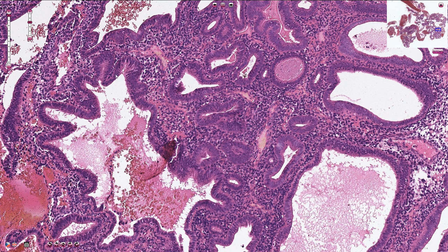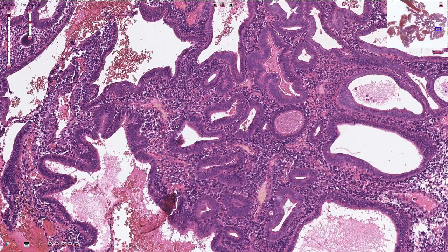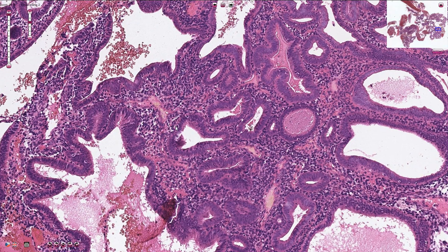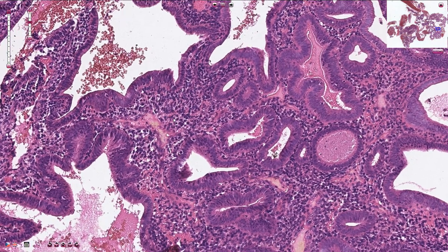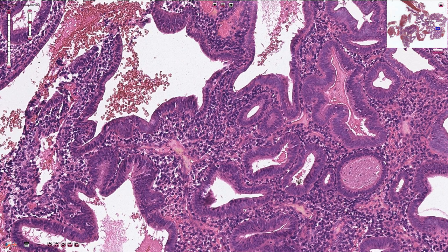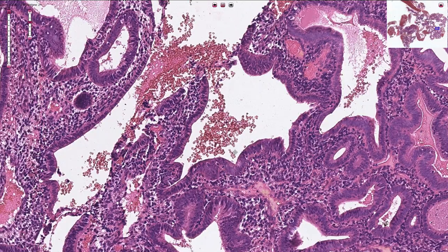Some of these proliferative endometrial glands can be quite dilated and irregular, but no atypical epithelial component is found. In between the endometrial glands we see normal endometrial stroma composed of stromal cells, sometimes with dispersed mitotic activity.